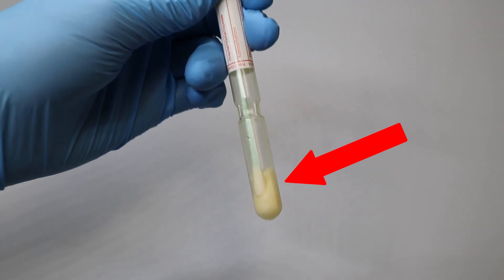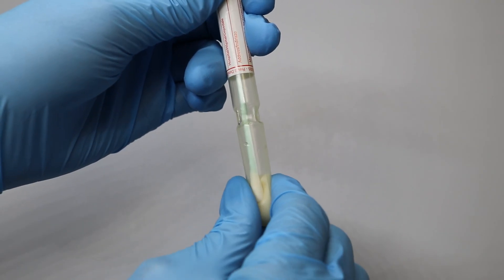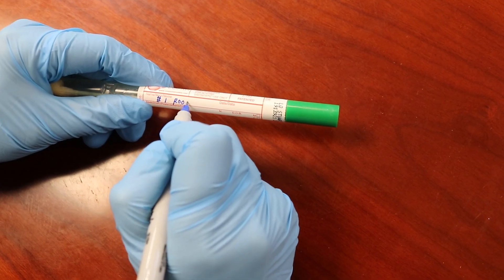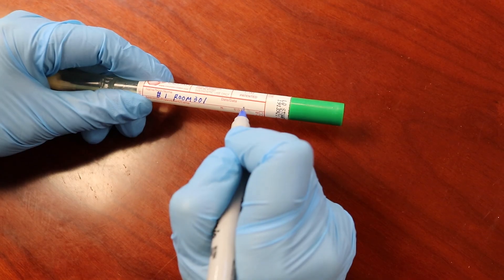The sponge inside the tube contains a bacterial medium. Squeeze the sponge to moisten the tip of the swab. Label the swab with a unique ID number and sampling location, then fill out the COC form accordingly.